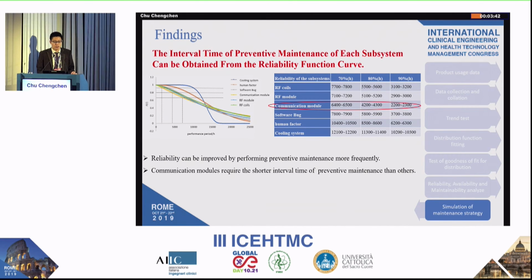The interval times of preventive maintenance of each system can be obtained from the reliability function curve.